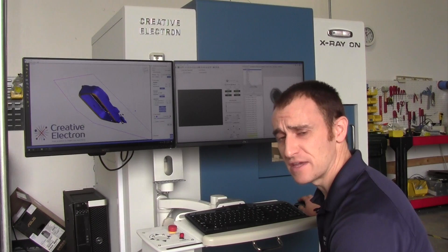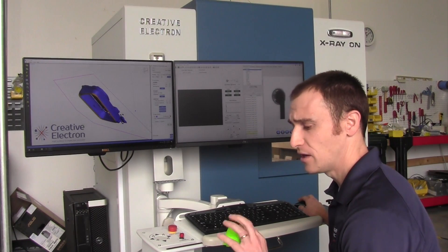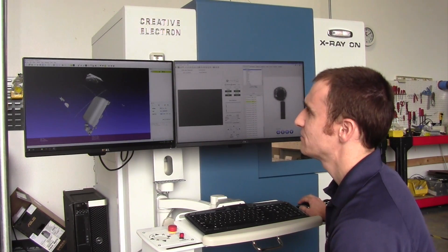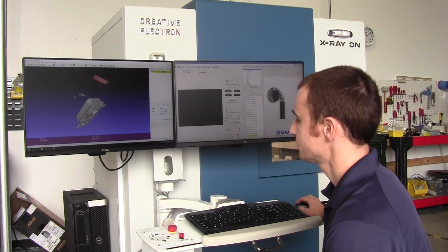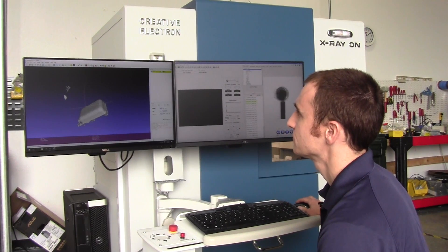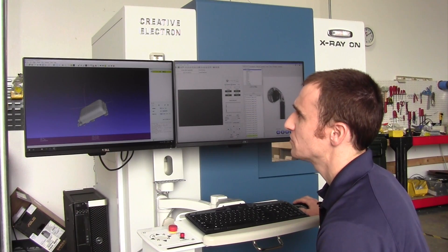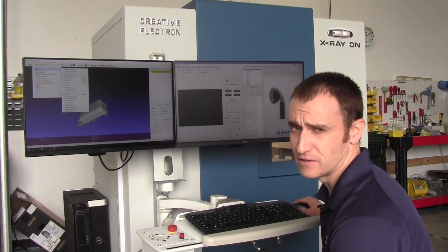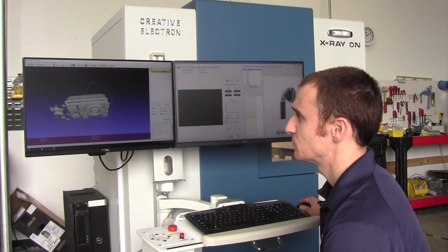Now I take the surface data, save it as an STL, and import that data into MeshLab where I can clean up the surface. I import the surface into MeshLab and remove the extra little bodies we don't need. We also apply some filtering to smooth out the surface and make the file a manageable size.